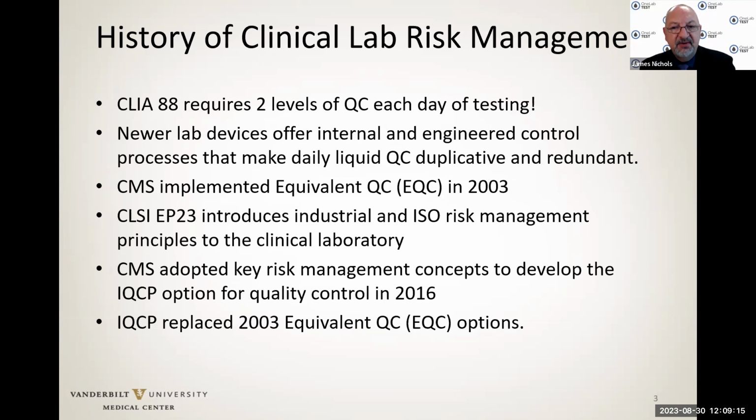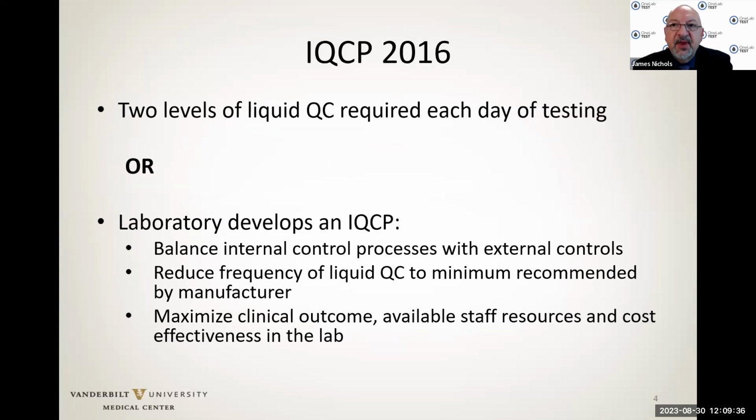CMS adopted key risk management concepts into the individualized quality control plan concept and that option for quality control in 2016. At that time, IQCP replaced the 2003 equivalent quality control options. Now, the IQCP in 2016 gives you 2 options. The laboratory can continue to run 2 levels of liquid QC required by CLIA 88 each day of testing, or the laboratory can develop an IQCP.